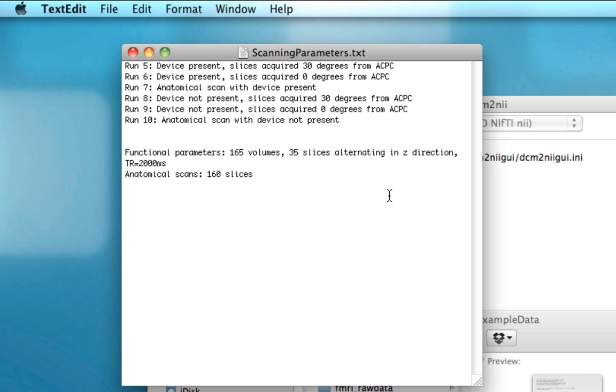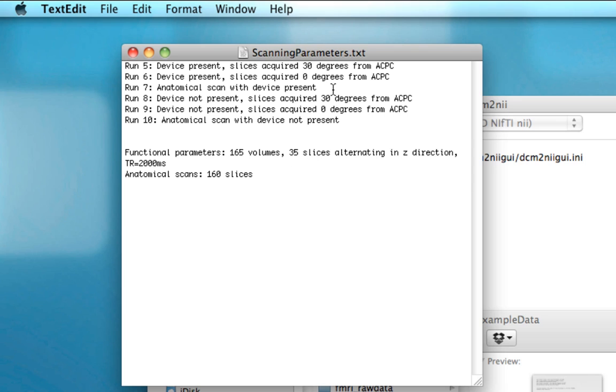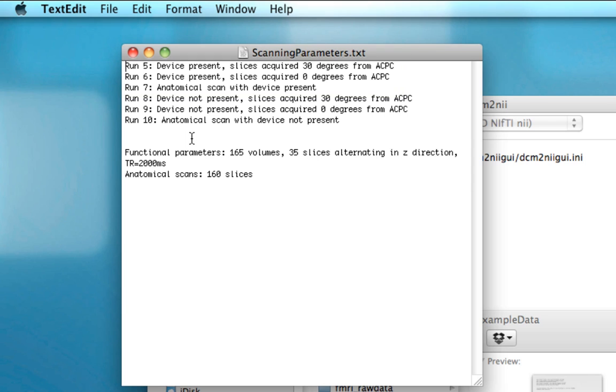In this experiment, what happened was we had a device next to a subject's head, which is my head, and we wanted to see whether it would produce any artifacts. So the parameters here are there are 165 volumes for each functional run, with 35 slices in the z-direction and a TR of two seconds. The anatomical scans have 160 slices. For now, the only runs I've provided for you are runs five through seven. This is a very simple task where I just did tapping my right hand, tapping my left hand, and then holding my breath, and also exhaling.